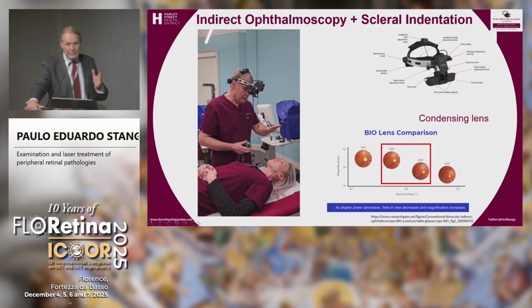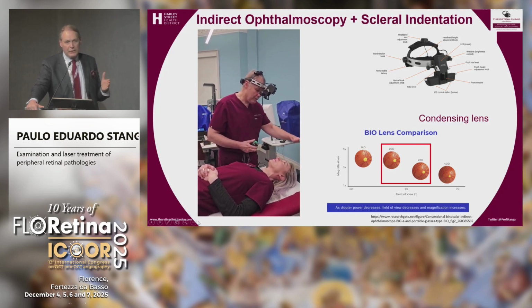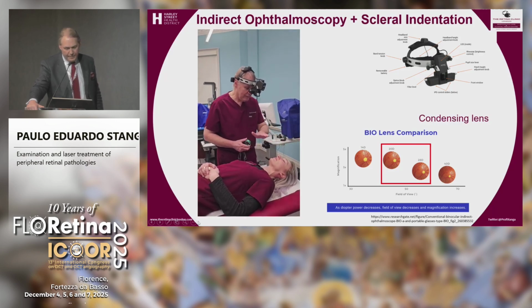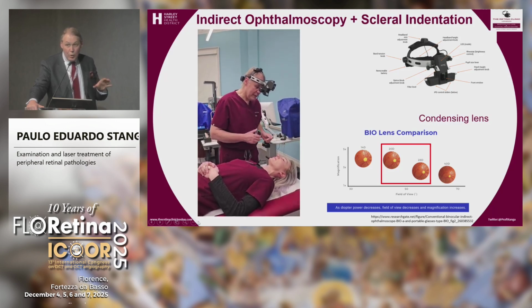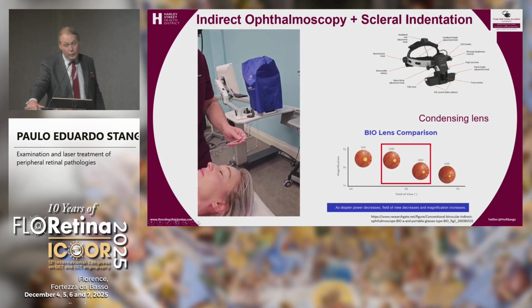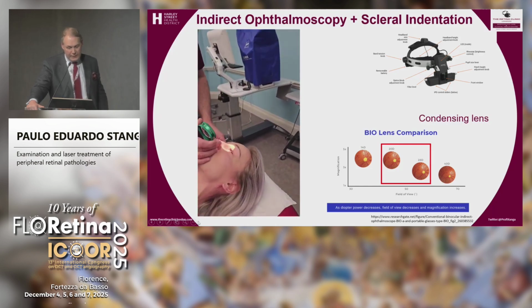Remember, patients are afraid. What is he going to do? He's going to press on my eye. No, we are not pressing on the eye. And start with low light. Ready? If you have any discomfort. I always start with the left eye, don't ask me why, and I go clockwise.